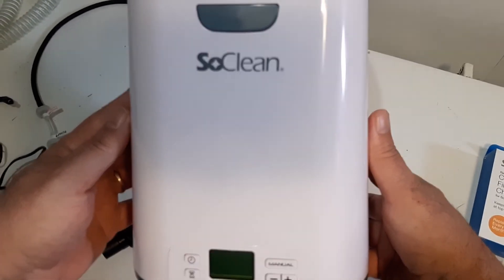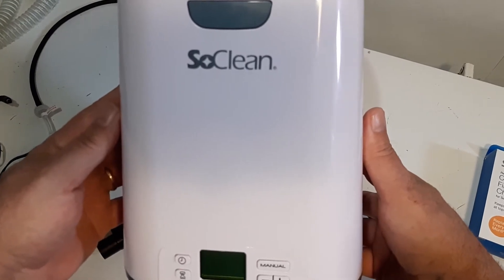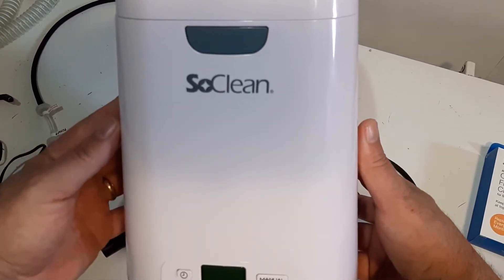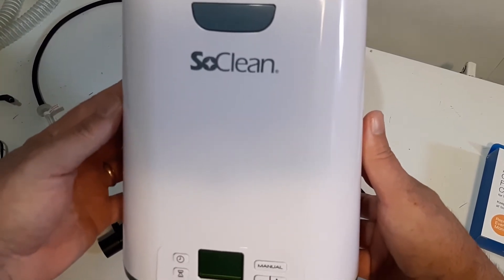Now I picked this up locally here, and $395 — that's Canadian price — and I find that very expensive. Anyway, we picked it up today, and we're going to look at some of the features of this SoClean disinfecting device.